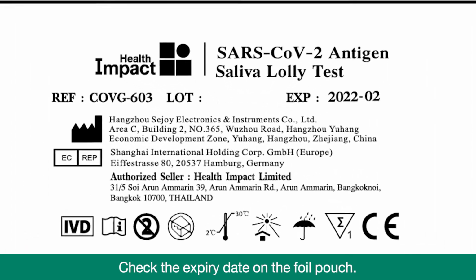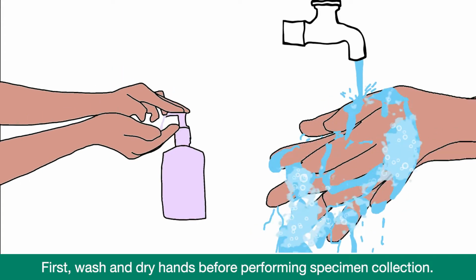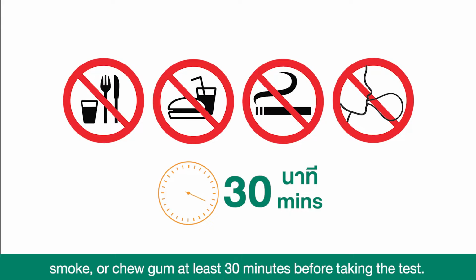Check the expiry date on the foil pouch. Do not use the test if the expiry date has passed. Specimen collection. First, wash and dry hands before performing specimen collection. Do not eat, drink, smoke, or chew gum at least 30 minutes before taking the test.